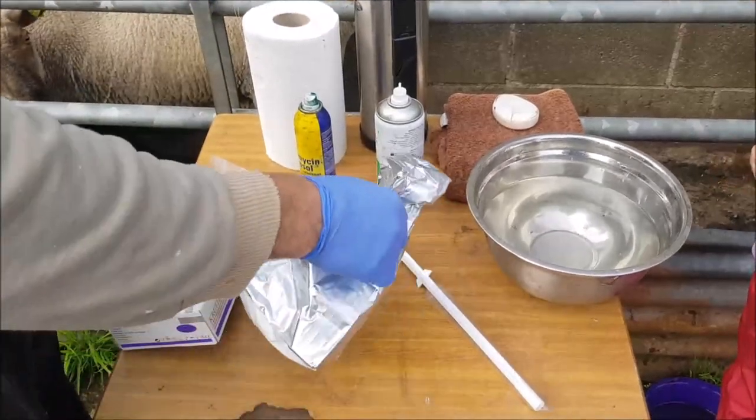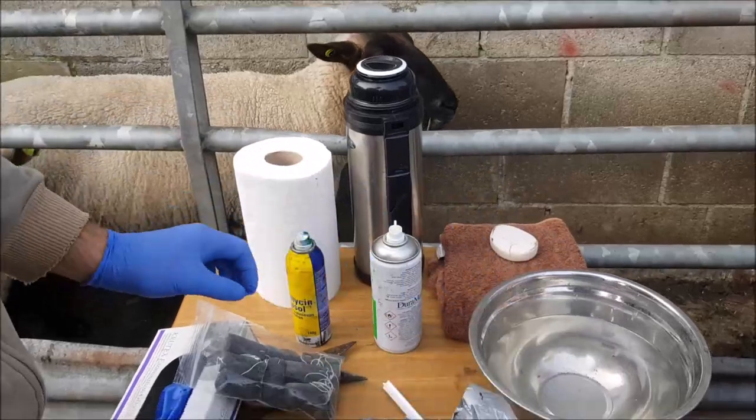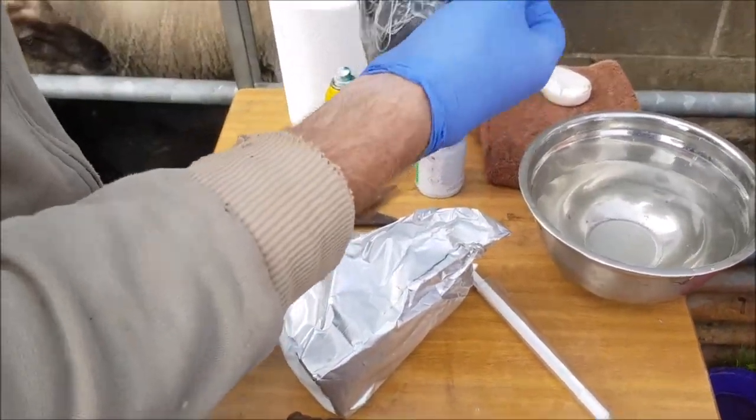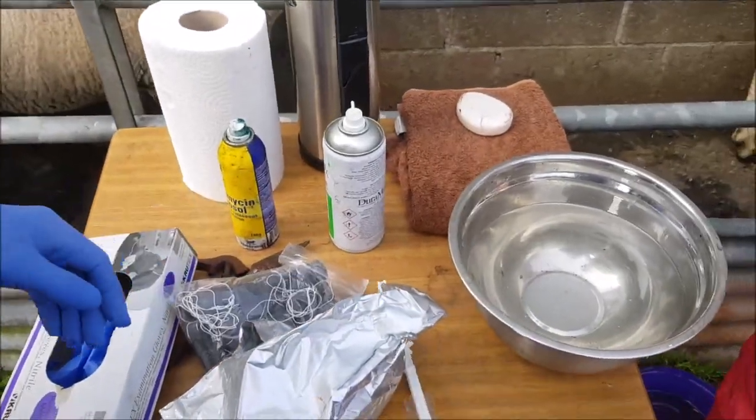We are going to sponge some ewes. We have 30 ewes to sponge. There are two different types of sponge — this white one here — and just depending on where you get them, they are already impregnated as well, the sponges. This is the applicator.